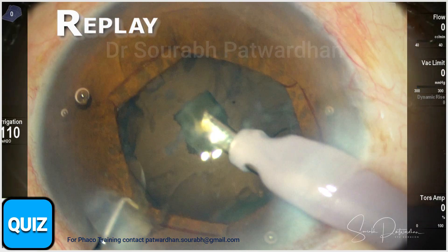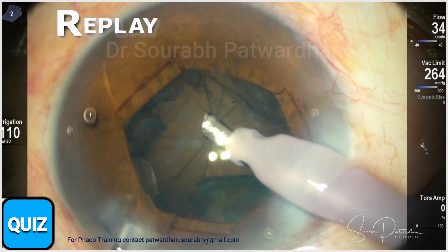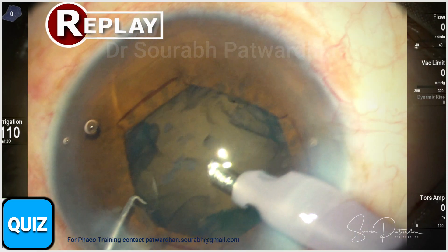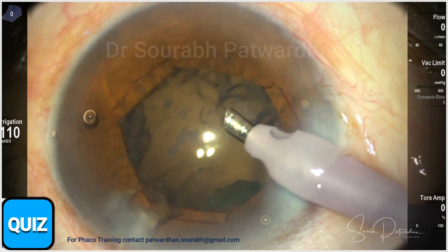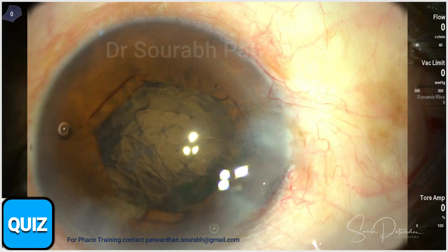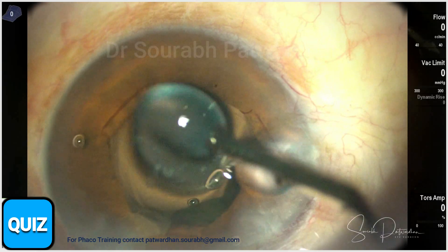And there it happened — watch it again, more carefully. Check the vacuum parameters also on the right. This is the moment that every surgeon fears: the phaco tip caught the posterior capsule. I'm not sure what has happened, so I push some OVD with my non-dominant hand and reassess the situation. There are a few nuclear fragments still remaining, and since this is a hard brown cataract, we can't leave those pieces.